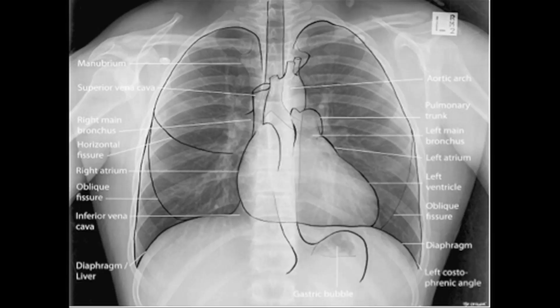It's important to follow down the airways — follow that trachea down to the carina, going to your right and left main stem, taking a look at the heart itself, identifying the different parts of the heart. Are we referring to the right atrium? Are we referring to the left atrium or the left ventricle? It's important to see that you can define the ribs and see the diaphragm. Take your basic anatomy and apply it to a chest x-ray to get used to the images that you see.